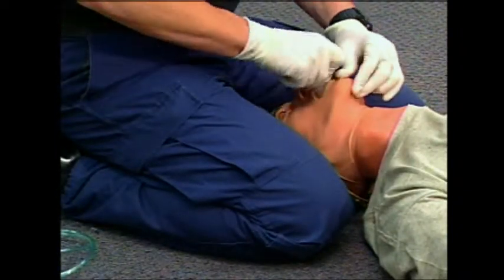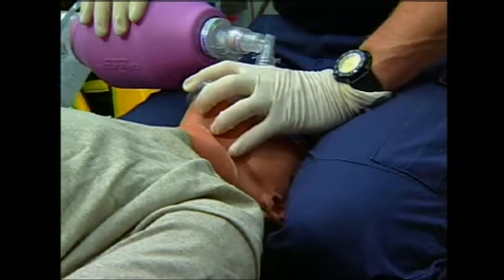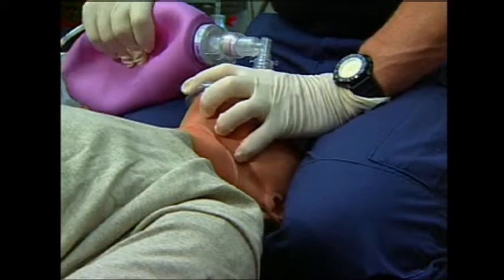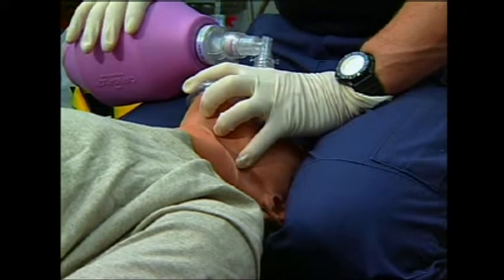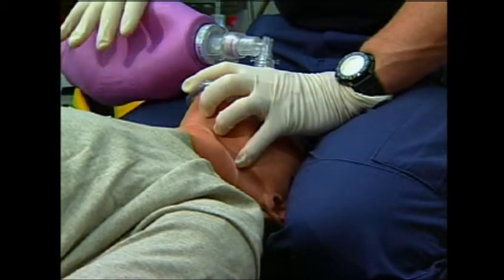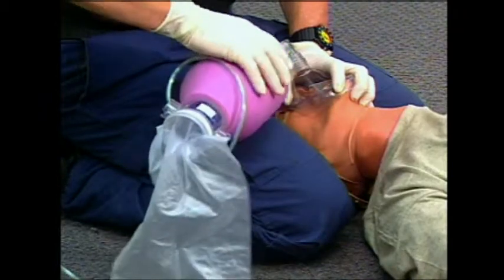After insertion of the OPA, encircle the mask with your thumb on the nose part of the mask and your first two or three fingers on the jaw part of the mask. Hook your ring finger and little finger under the lower mandible to keep the mandible elevated and to avoid any loss of the seal with movement of the chin.